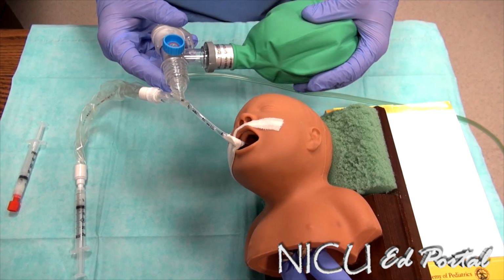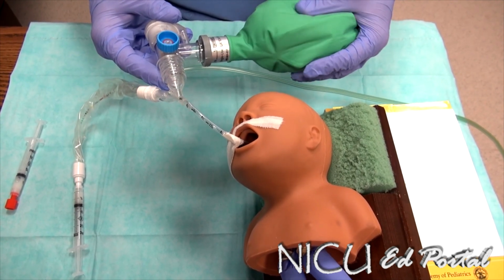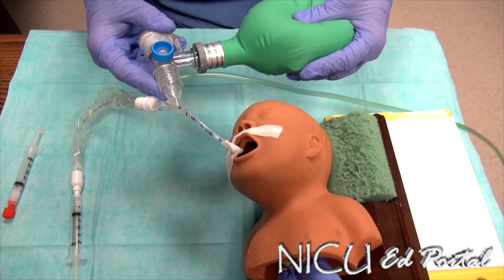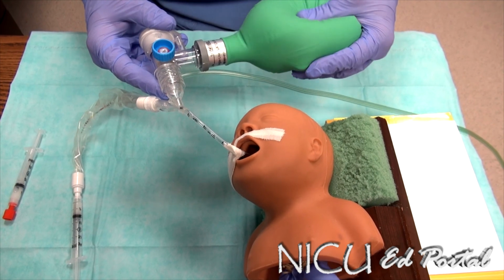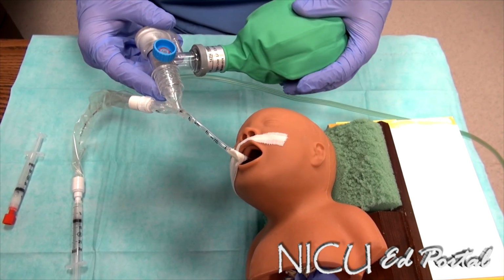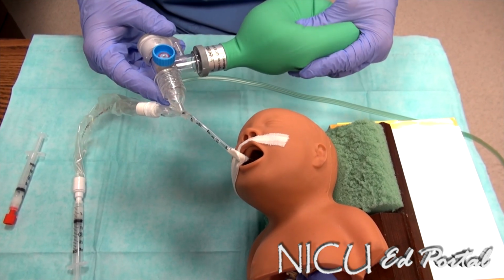So after removal of the catheter, like mentioned before, we want to bag at a rate of around 40 to 60 breaths per minute. And while on the right side here, we would want to bag between 1 to 2 minutes, making sure our vital signs are stable. And as we come to the end of our 1 to 2 minutes, and we have no remaining surfactant in the ET tube and our vital signs are stable, we will then return the baby back to his or her back or neutral position.